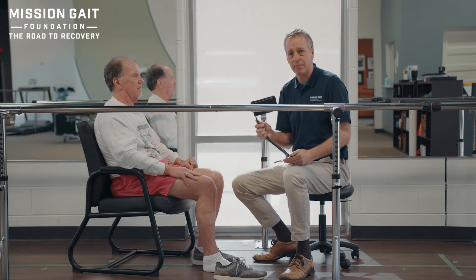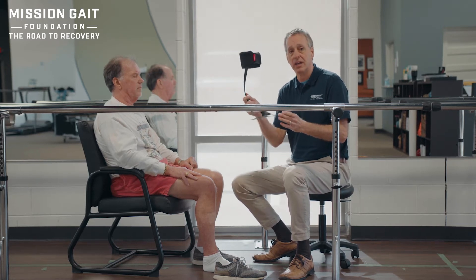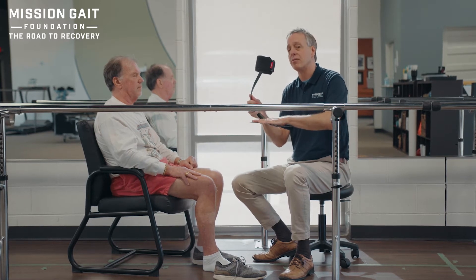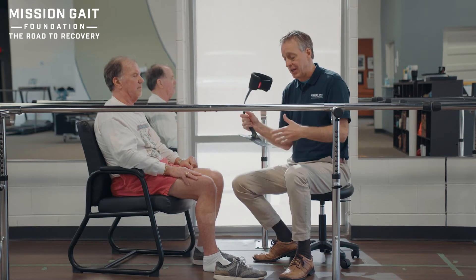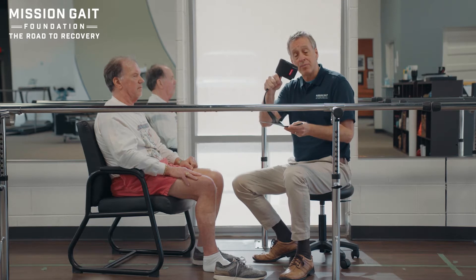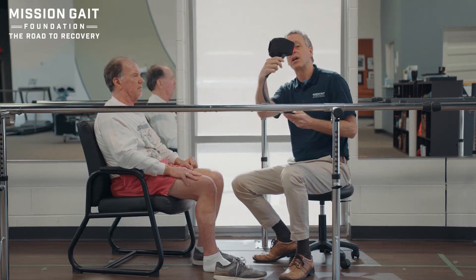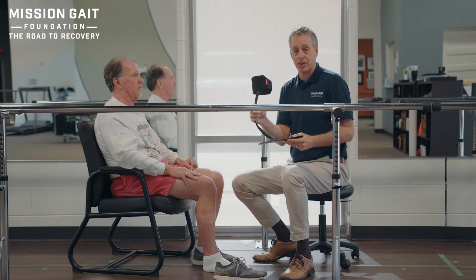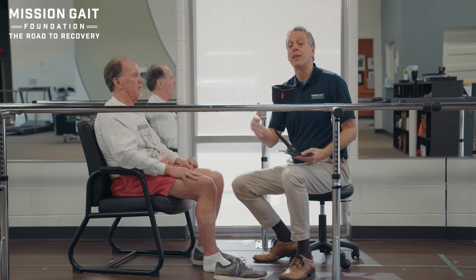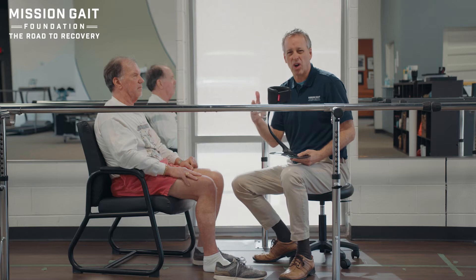We want patients to understand that. It also means, though, inside your shoe it's going to take up a little bit of space. It is a kind of rigid plate, so using an insert over top of it is always more comfortable, and making sure your shoe has enough room. The brace gives you energy back but can also push you into hyperextension. This coil brace gives us a lot of return but not so much pressure into extension. But if the patient has an issue where the knee wants to hyperextend, we have to check whether the brace causes or increases that.